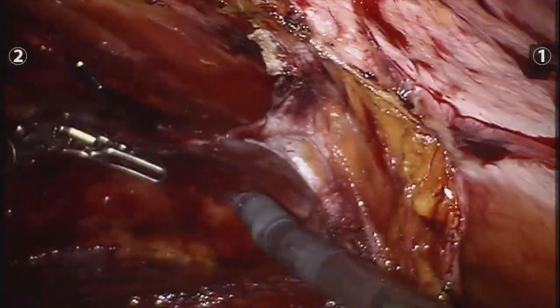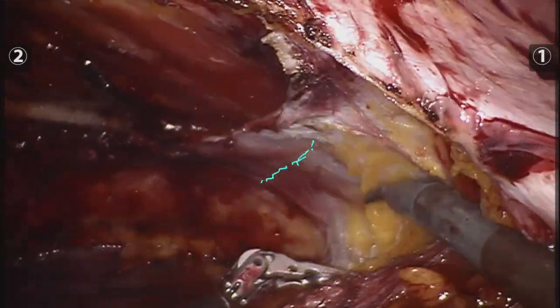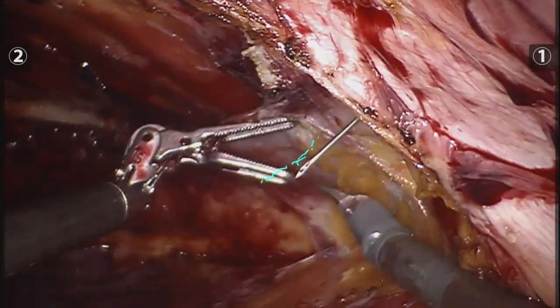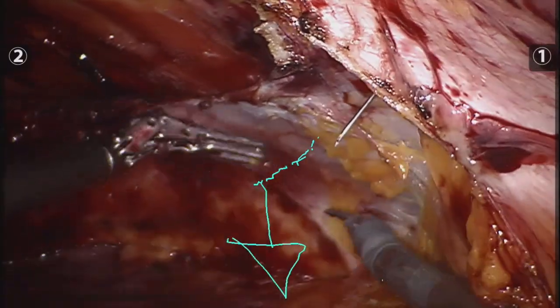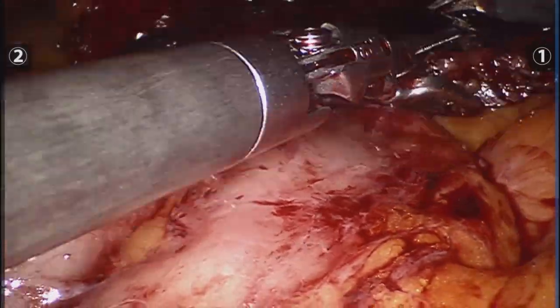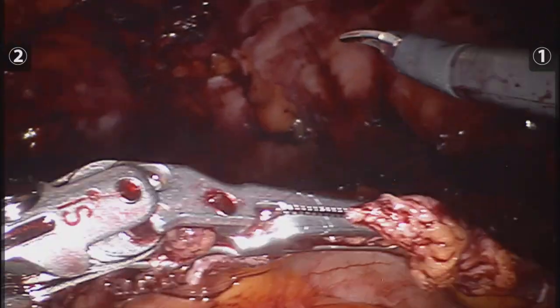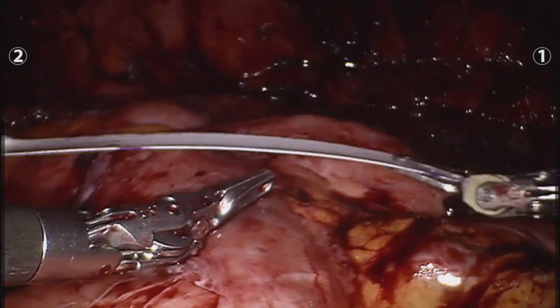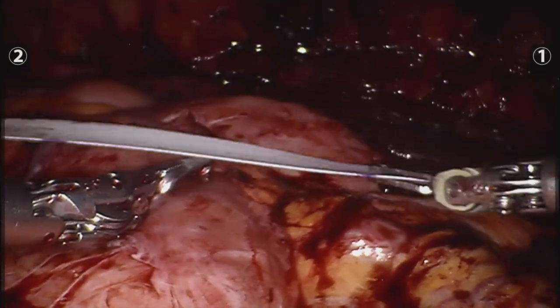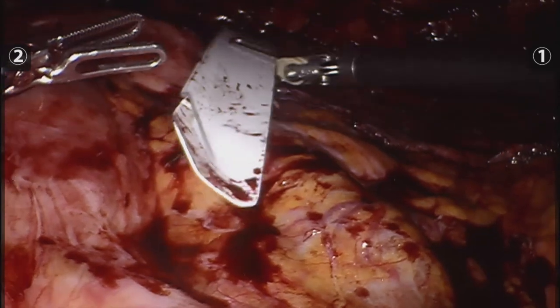As we're getting ready to do the second docking, I tried to be very efficient and not have to re-dock once I docked the patient on the other side. I asked my assistant to point where the subcyphoid region was so I made sure I had an overlap long enough for the mesh. I made sure the peritoneum was nice and flat on top of the viscera, then got out of the console and prepped the mesh after measuring the space to select the adequate length and width.